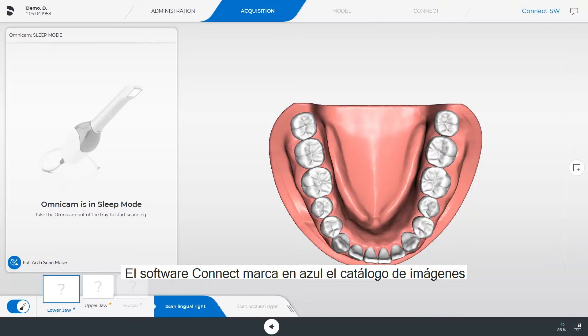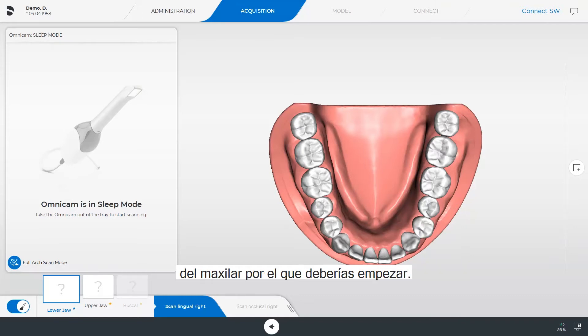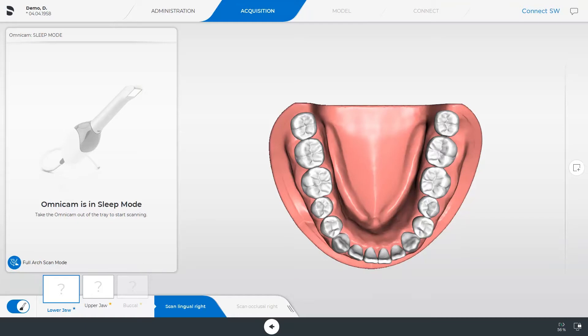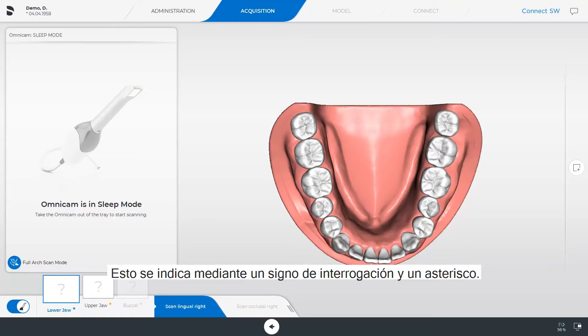The Connect software marks the image catalog of the jaw you should start with in blue. All displayed image catalogs need to be scanned before you can switch to the next phase. This is indicated by a question mark and an asterisk.